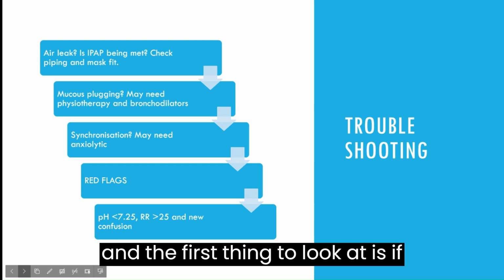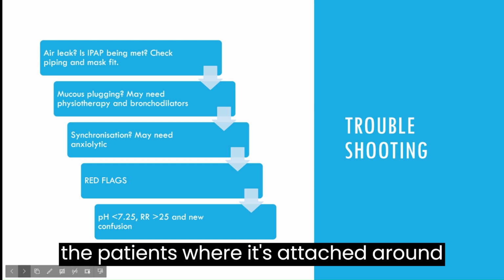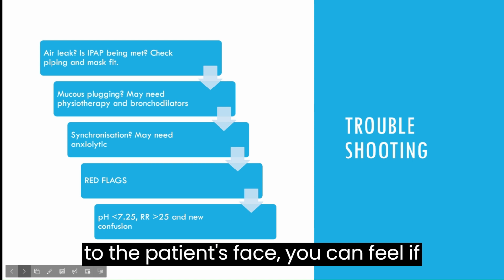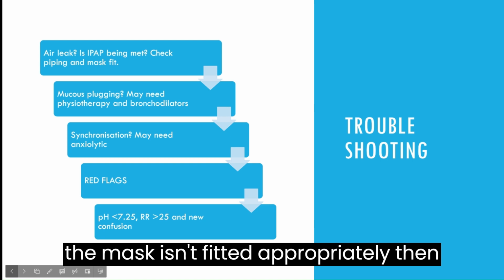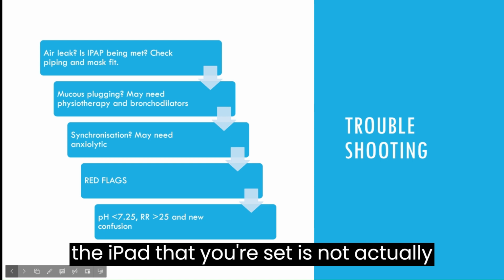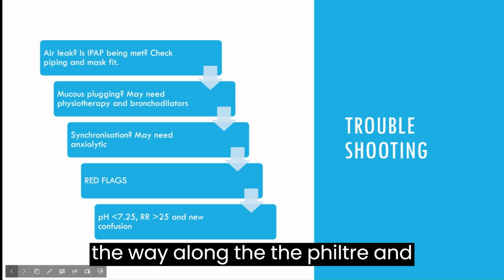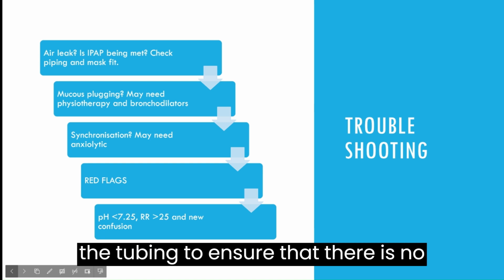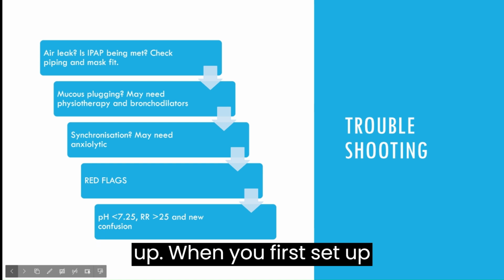And the first thing to look at is if there's any air leak. You'd be able to hear that usually first of all, but then if you actually go towards the mask where it's attached around the patient's face, you can feel if there's any significant air leak and adjust the mask appropriately. Because if the mask isn't fitted appropriately, then the IPAP that you've set is not actually being met. And I would also check all the way along the filter and the tubing to ensure that there is no problem with the circuit that's been set up.